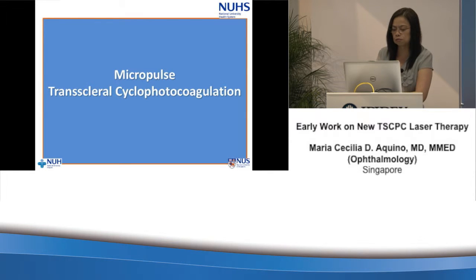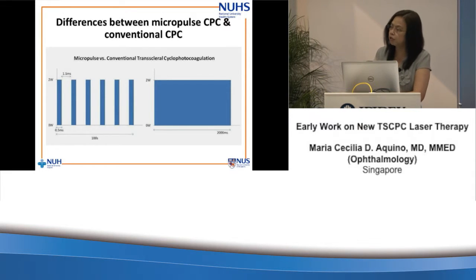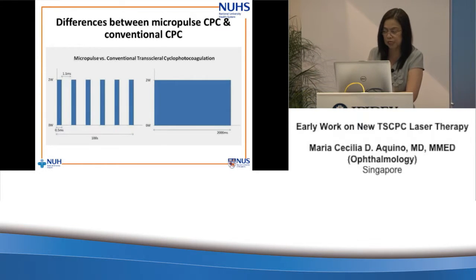I know that everyone is aware of the laser pulses delivered by the two different types of laser. If you have a continuous wave, then you deliver a continuous train of high laser energy in the duration that you have chosen. But in micropulse mode, the train of pulses is divided into repetitive small and short pulses, where there is an on period for the laser to fire and an off or rest period for the laser to be off.